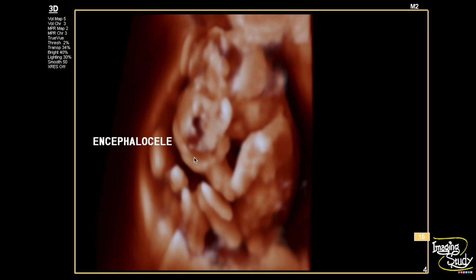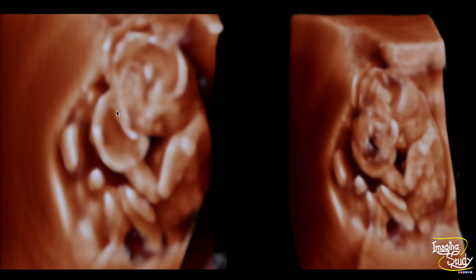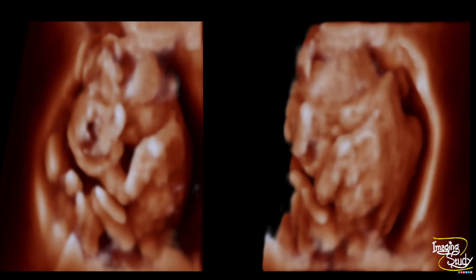Let's see some other 3D pictures of this case. Here again is the herniated structure. This is the head region. You can see pictures from different angles — this is the posterior aspect of the head. There is no skin defect over the spine.